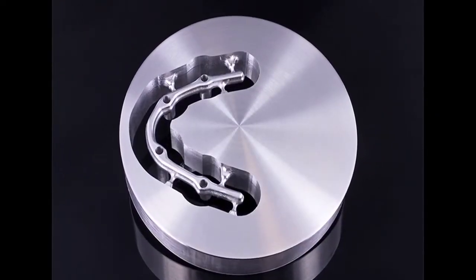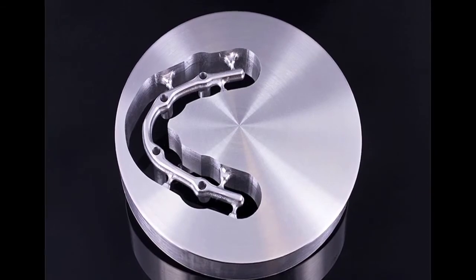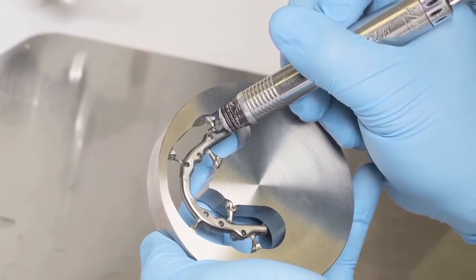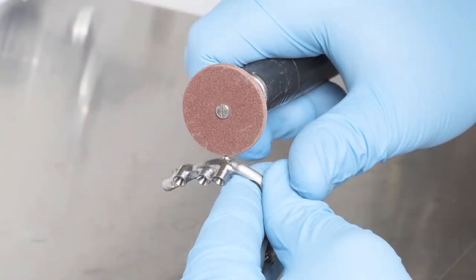When the milling process is complete, the bar undergoes a proprietary treatment process to ensure maximum flexural strength. The sprues that hold the bar within the block are cut and removed, followed by a final hand polish.